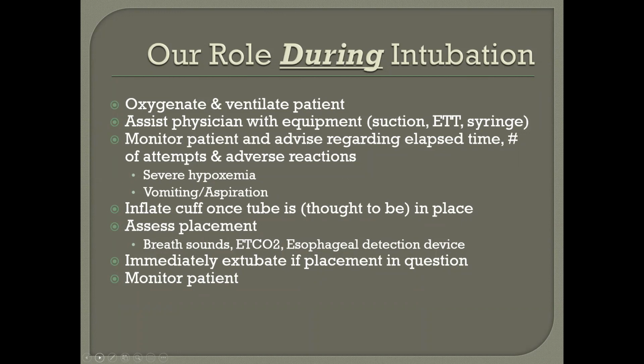it's probably in the trachea. If it does not reinflate, it's probably in the esophagus. The esophagus is actually collapsing around it, versus the trachea having the cartilaginous rings. Not a bad way to detect it, but they're becoming less in favor these days.